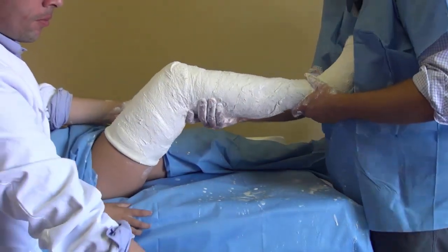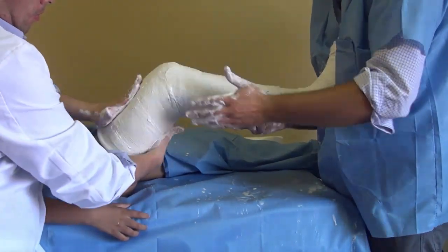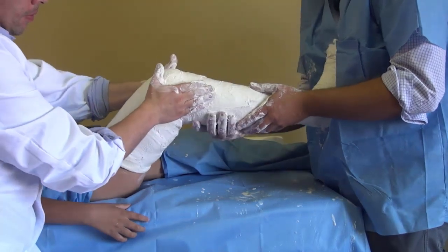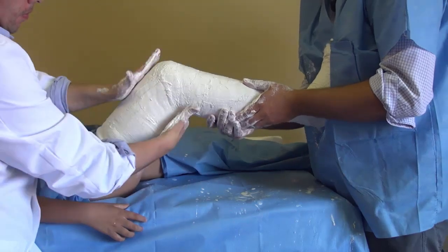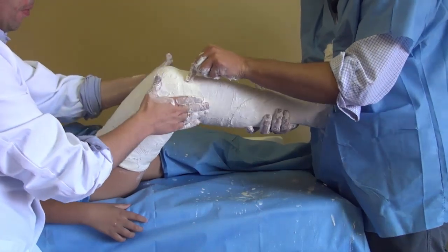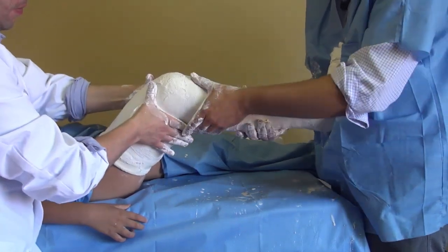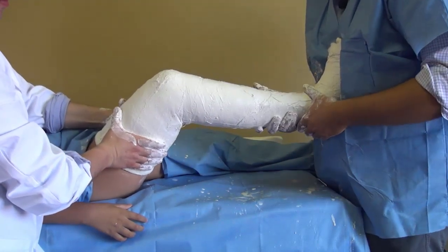Before the cast gets hard, it's very important that you mold the supracondylar area. The cast will be held in place by the supracondylar eminences of the femur — both the lateral and medial condyle — so you have to mold it very nicely, same as we did at ankle level. You can also go around the patella and the patellar tendon. And that's it for our long leg cast.